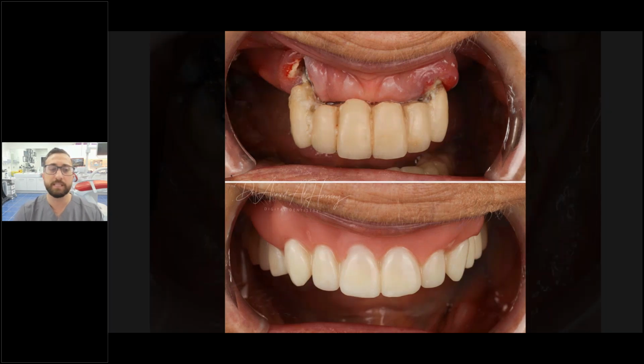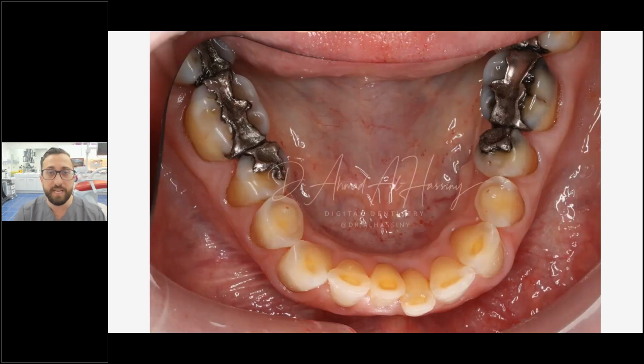The other thing is obviously printing crowns and temporary restorations. Whether or not permanent crown restorations that are printed will ever live up to the hype, so much talk is going on about printing restorations for full crowns that are permanent, that will last. I still think a resin is a resin, and it is quite hard to beat zirconia or lithium disilicate, but I still think they have their place.